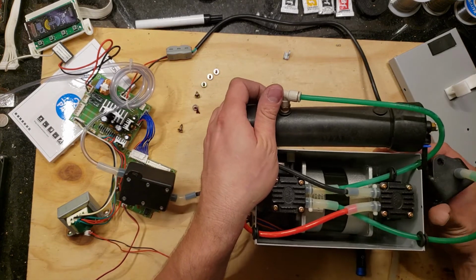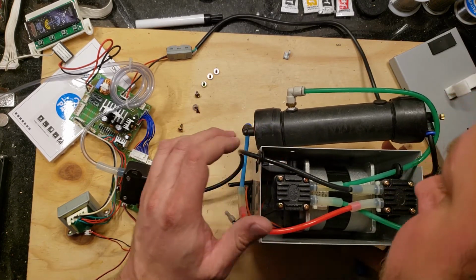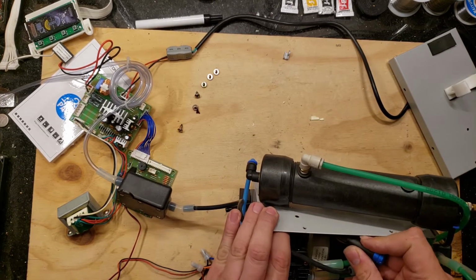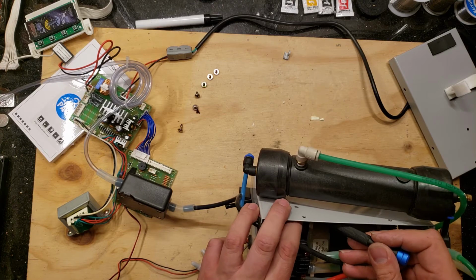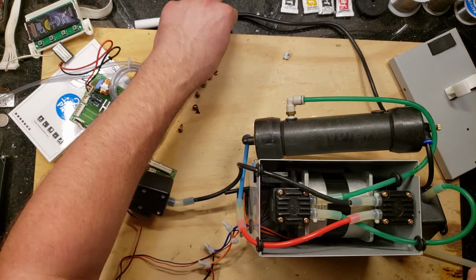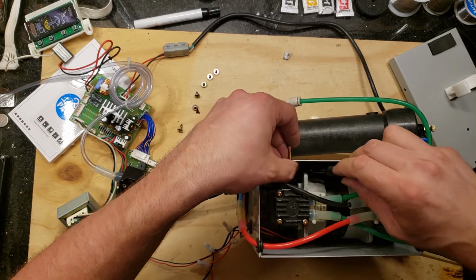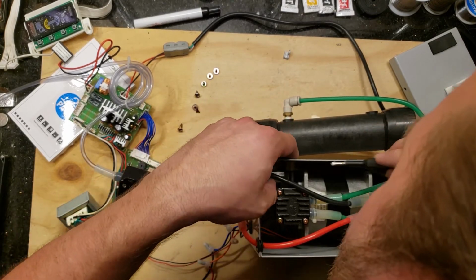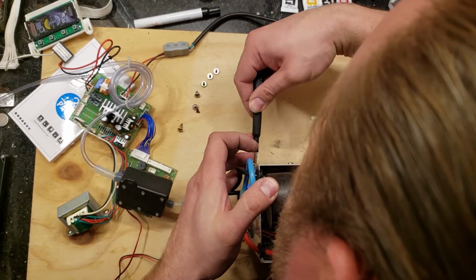So one on this side sucking air into this box, and then one on that side that then shoots the air out. And it looks like this one has lost its bolt, which I think was one of the large bolts that was loose inside the case. Let me try and fix that real quick, because I plan to keep this unit as is. I think that was holding the fan. So let's see if I could reassemble it real quick. The bolt is here, but apparently it still needs a nut. So let's see if that's still in the box.